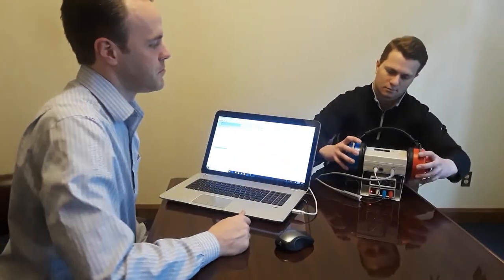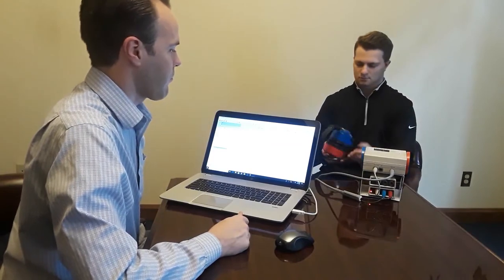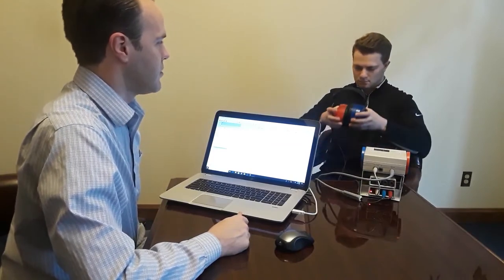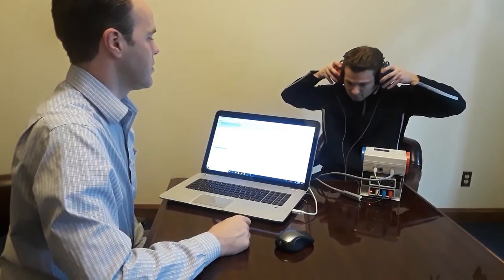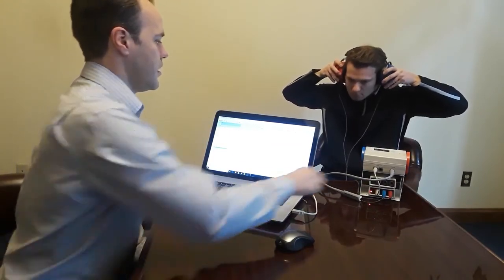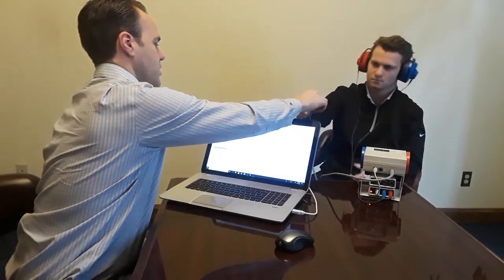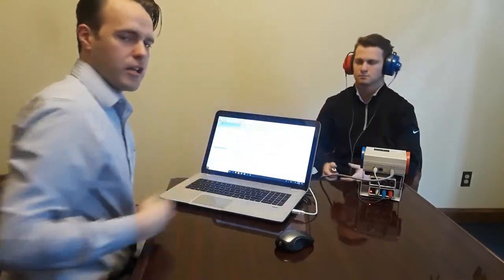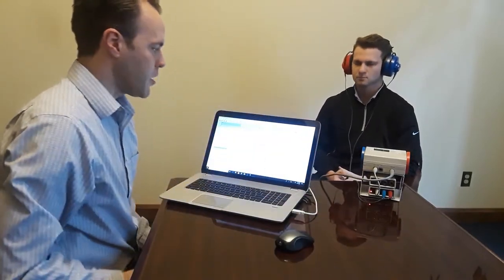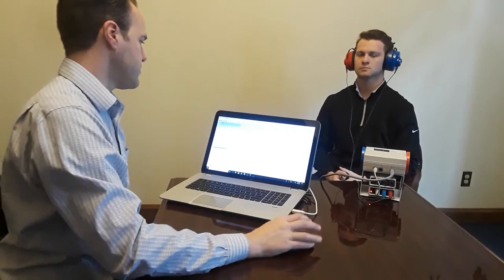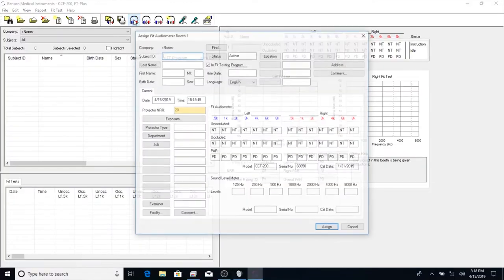Now perform an audiometric fit test using the CCF 200 fit test. Please put on the headset. And here's the patient response switch. We're going to do an unoccluded test first, which means that there's no earplug inserted.